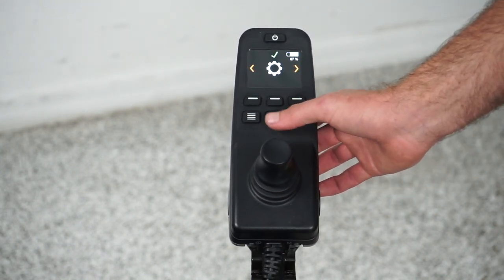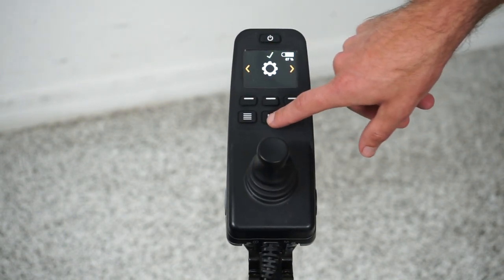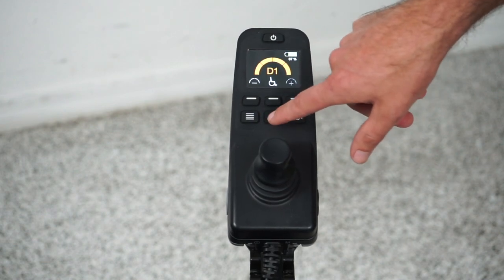If you get lost in these menus and it gets a little confusing, just press mode and you can get back to either your function menu or your driving profiles.